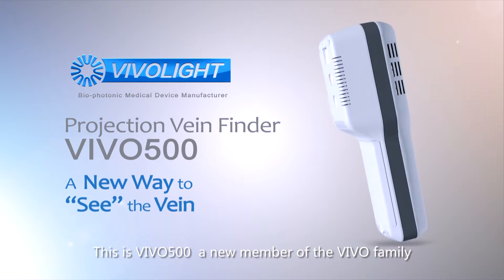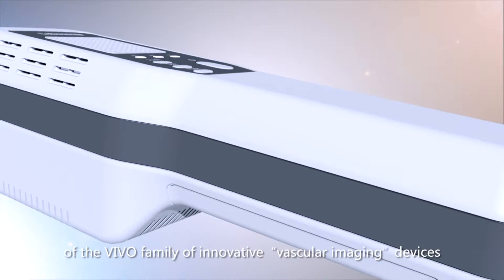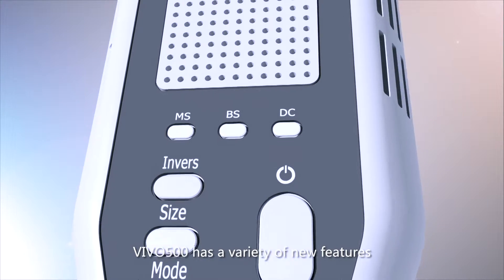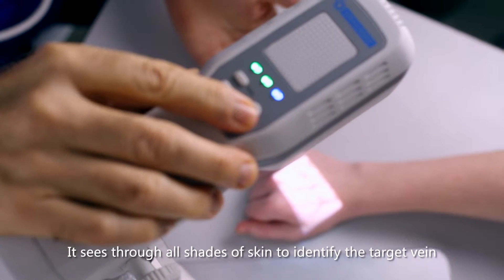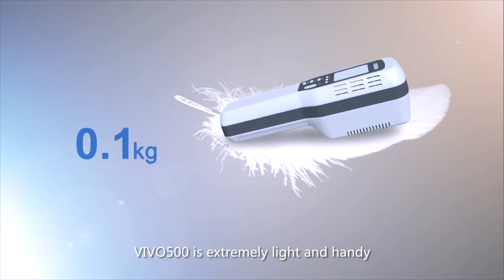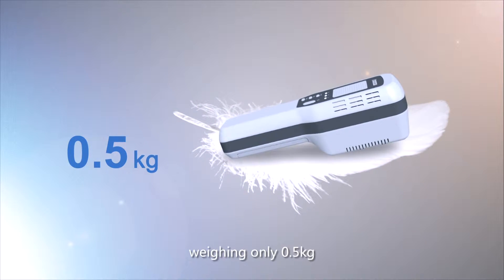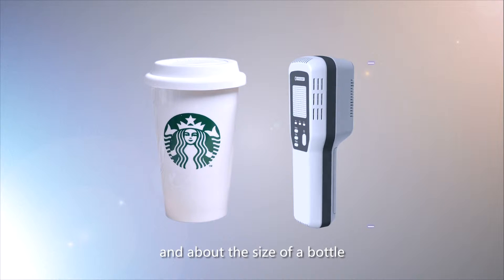This is VIVO 500, a new member of the VIVO family of innovative vascular imaging devices. VIVO 500 has a variety of new features. It sees through all shades of skin to identify the target vein. VIVO 500 is extremely light and handy, weighing only 0.5 kilograms and about the size of a bottle.